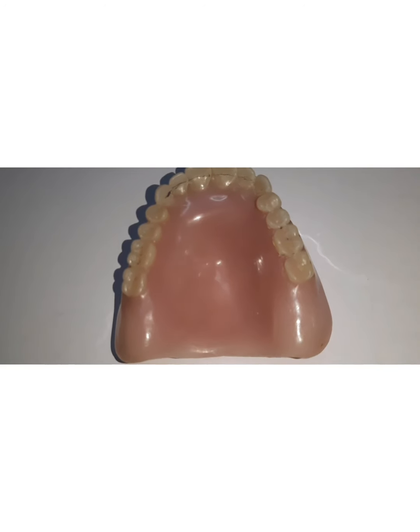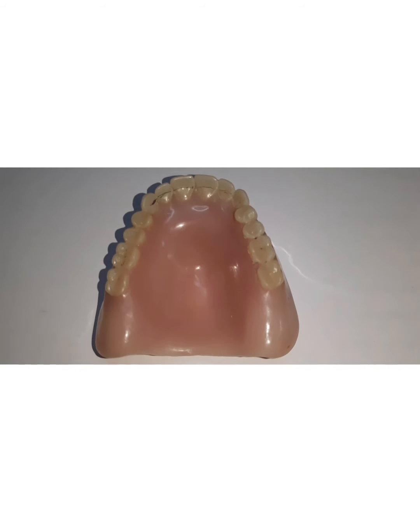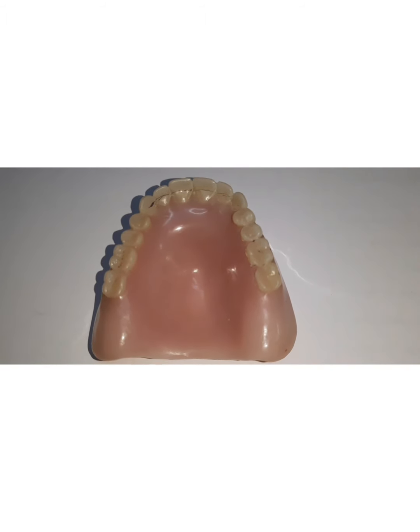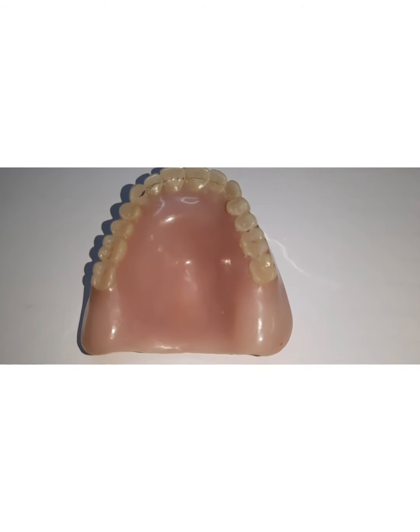But the drawbacks of this material are they cannot be used in thin sections, especially in cases where the interarch space is very less. So in those cases, it is difficult to use acrylic resins because they require adequate thickness. Because if you don't give adequate thickness to the denture base, there are all chances that it will fracture.